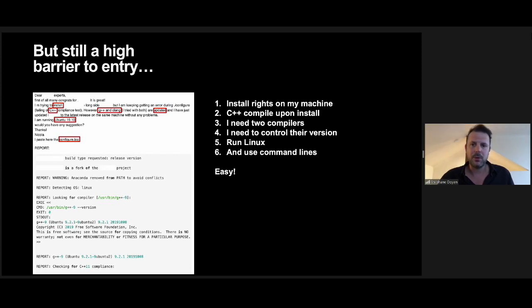But what I found as well is that the use of this software is still pretty daunting for someone who doesn't have a background in computer science or at least some elements of coding. And just to give you an illustration of this, this is a message I picked from one of the numerous ones you can find on some of the message boards out there. And I've blurred the name of the actual software that shows this message because we don't want to speak specifically on that one, but just illustrate how things can be for the user.